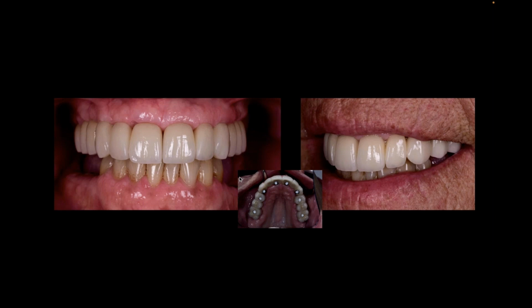And just to throw this out there, it's a little off topic, but it gets frustrating because I hear so much about everything's zirconia all on, everything's zirconia all on. That sounds great up front to me, and I do a lot of them, so I don't want to make it like I don't do them. But the concern for me is when something goes wrong, who's eating that, and how are you managing that time? We all know those pucks are $200-300. They're 6-8 hours of milling time.